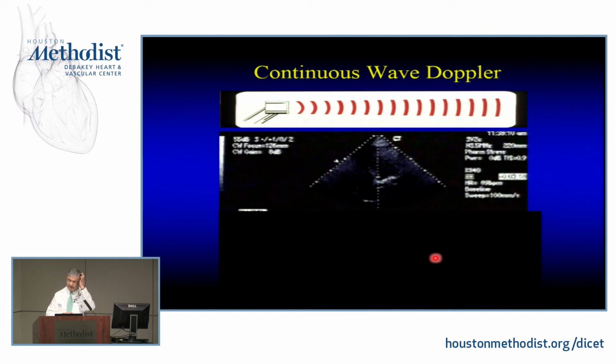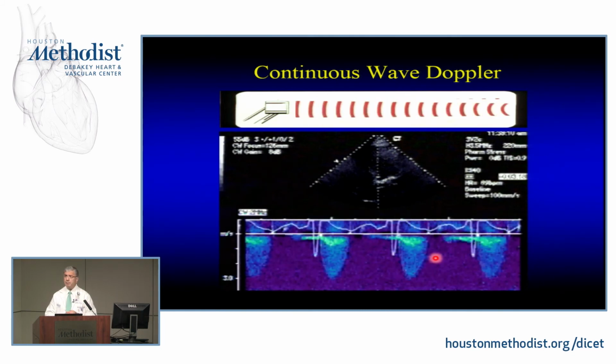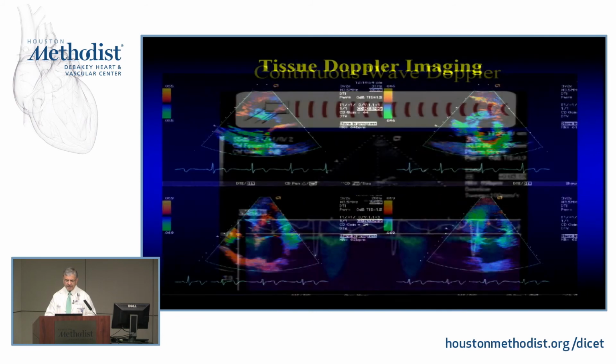So if I have somebody with aortic stenosis, just like this case here, but at the same time this individual has a dynamic obstruction inside the ventricle or in the outflow tract, all of them are going to be on top of each other. There's no range gating anymore. So in the unusual situation where something is funny, you have to think, where's the signal coming from? Because I cannot tell. If there's only an aortic stenosis and nothing else in between, you can take it to the bank. If there are different signals and there's something else on the way, be careful.